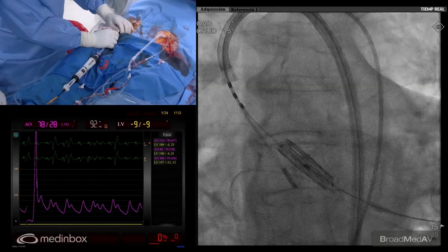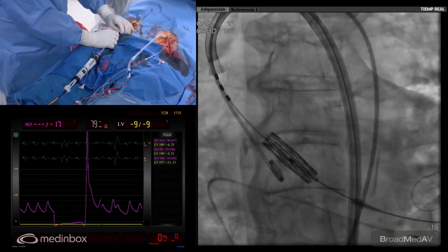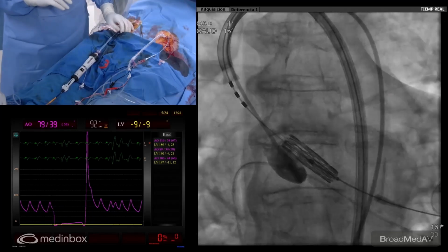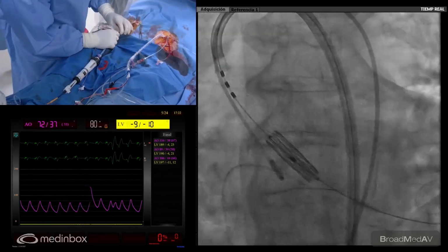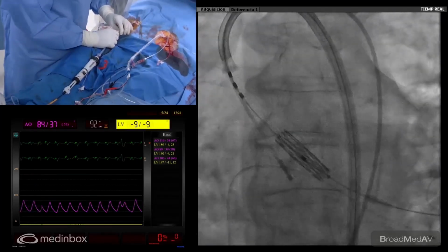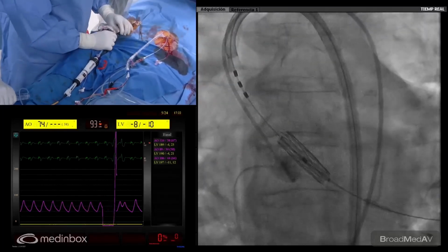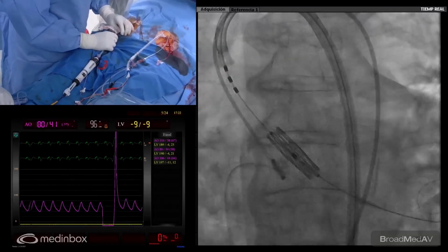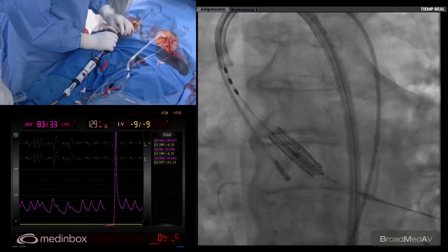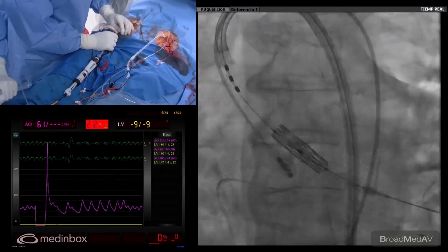Let's go with Cine. We are in the middle of the pigtail with the mark, no? You are, do you want a little bit higher? Okay, probably there. Do you like it? Yes. Test? Okay, I will put here. Little bit higher. Okay, so pacing, 180. Test. Let's go, Carlos.